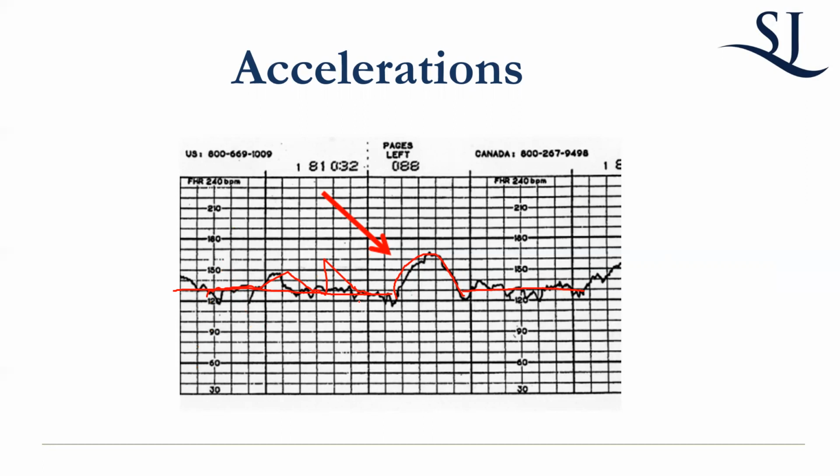And it's a fair question to ask whether it's necessary to say how long it is. You probably would say that it's a little longer, probably even more than that, because if this is 1 minute, then this here is probably maybe 30, 40 seconds. But you don't even have to go that far. If you can visually understand that, that's excellent. But that's the deal with accelerations.